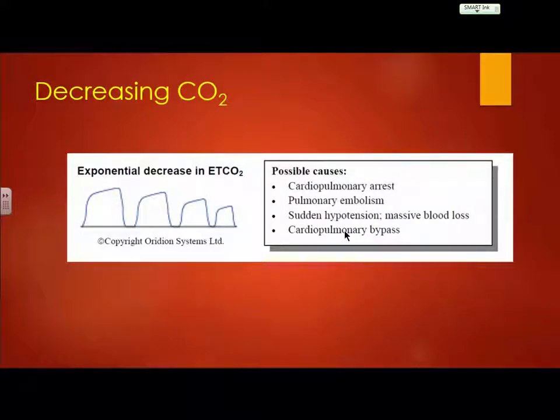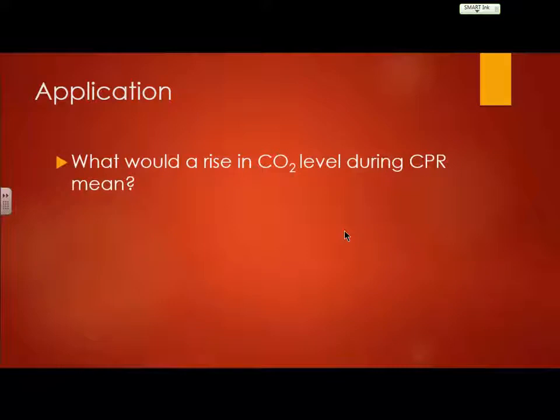All right. What would a rise in CO2 level during CPR mean? Yeah, possible return of circulation. Now, what do you do if I'm in my cycles and I look here and I see an increase in CO2, what do I do at that point? Yeah, just finish up your cycle. Continue doing what you're doing right there. It's just like when you shock somebody. You continue your cycle for a little bit. All right.